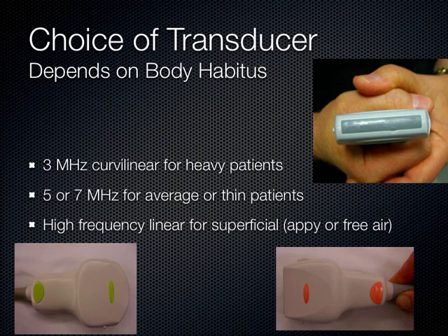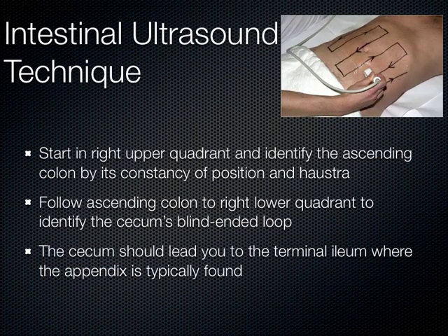Now, if I did have a very large patient like that guy we just saw, certainly I'd be leaning towards using one of my lower frequency curvilinear probes, hopefully one with a large footprint like the C60. But that being said, the linear transducer can usually get through a lot of this intestinal ultrasound.